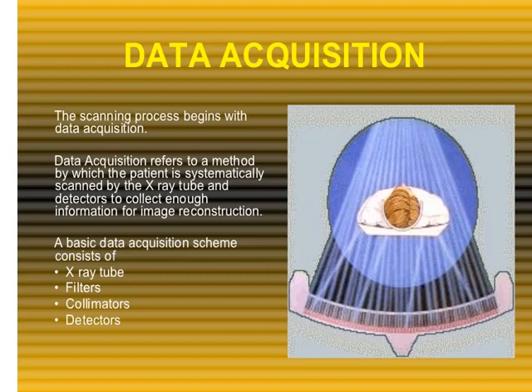The collimators convert X-rays into a very pencil-thin beam. Detectors absorb the X-ray photons and emit energy as visible light. It also consists of a photomultiplier tube that converts the photons to electrons. Analog outputs from these tubes go to signal conditioning circuitry that amplifies, clips and shapes the signals.